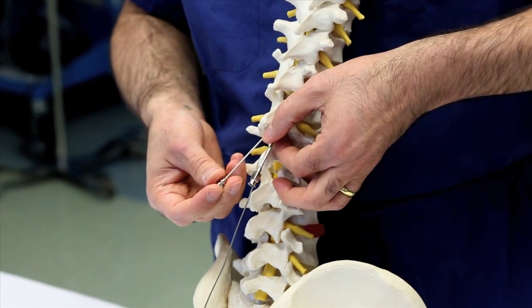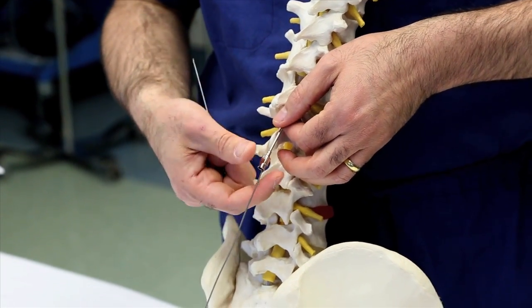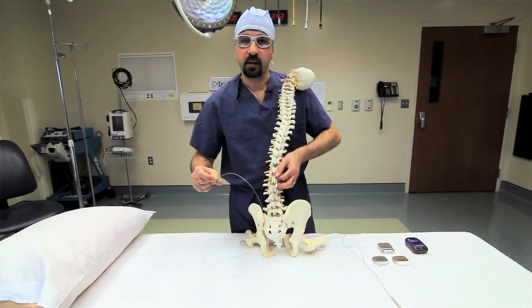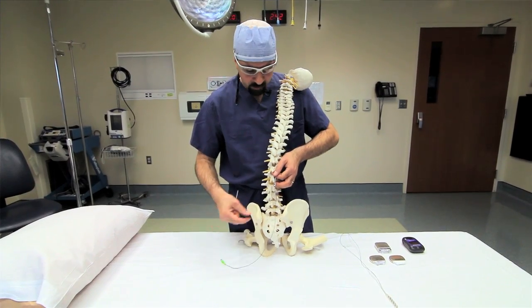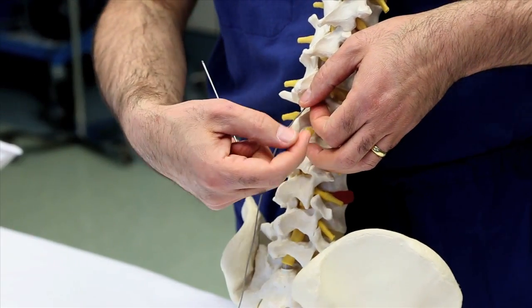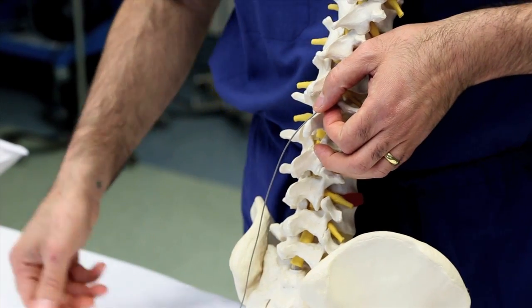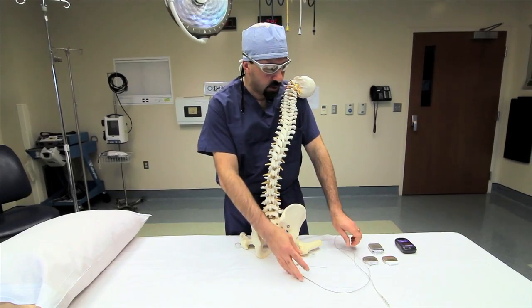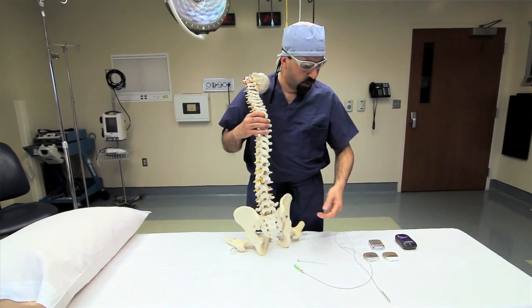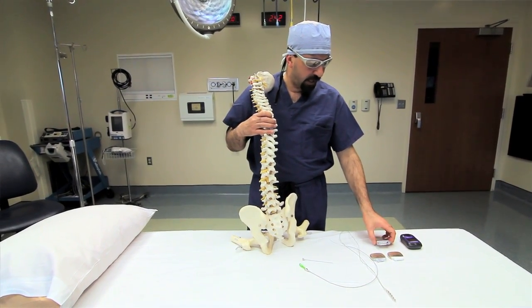We implant 2 leads, and the second lead will go through this one. Once we try the patient and the patient says I have good coverage, we take the needle out and start tying the lead into the deep fascia. The other incision, which I prefer to do in the gluteal area, is where we implant the battery.